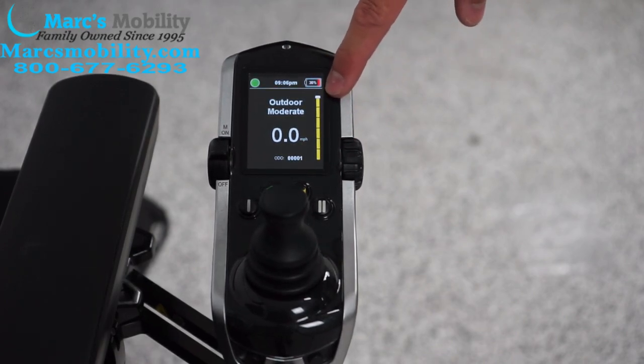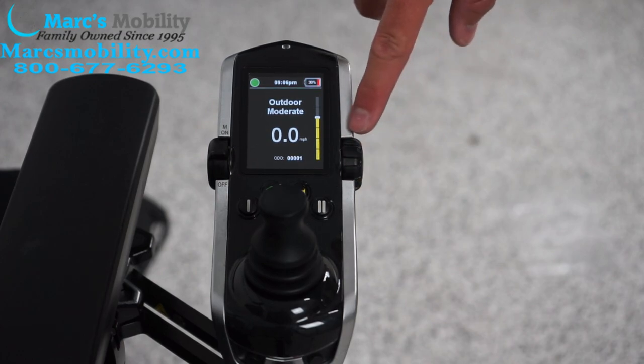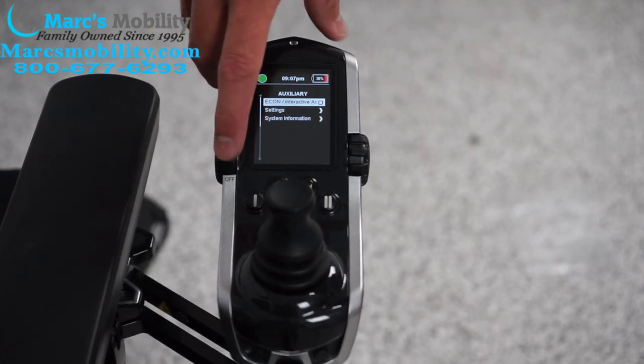On this side you have a way to scale down your speed. If you twist this knob down you can fine-tune it. There are four profile settings typically on these joysticks, which I will show you here.